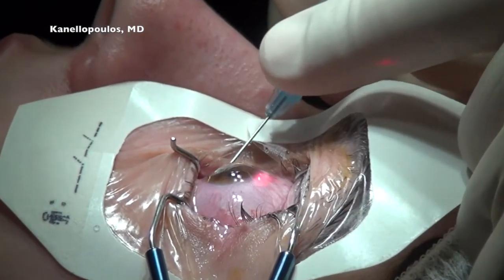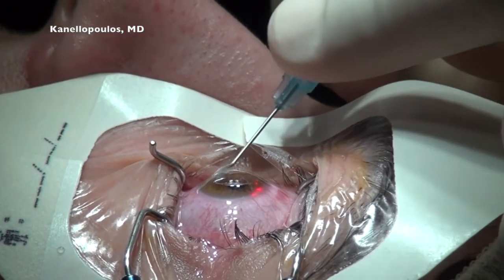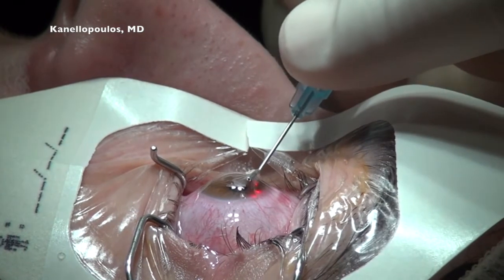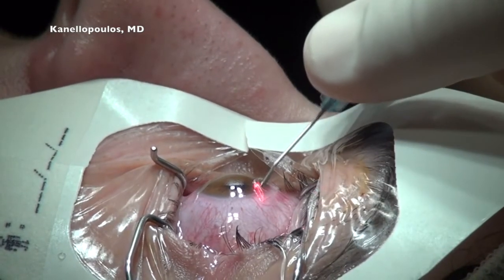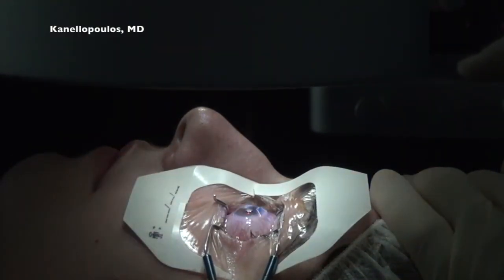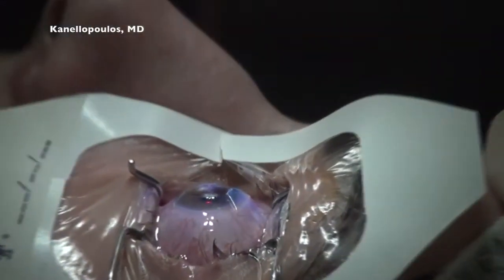We're seeing here how I'm lifting the flap from the hinge side down, releasing the very fine adhesions that remain after the femtosecond laser delineation. I'm tucking the flap onto itself in order to avoid having any particles from the laser room land on the backside of the flap. Here we're seeing the laser in action.